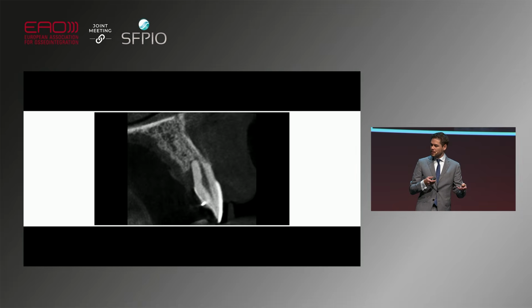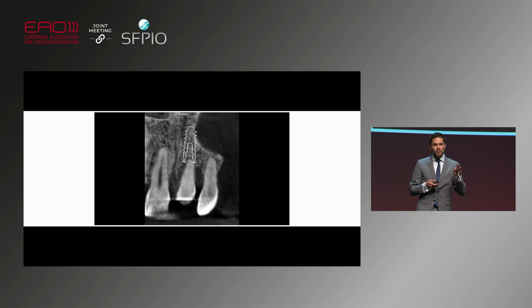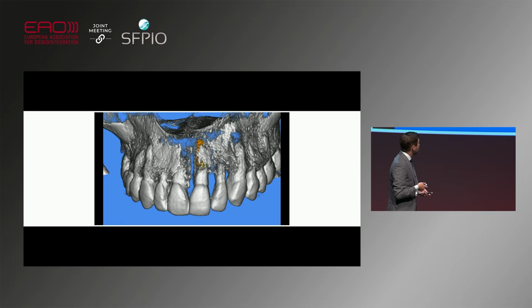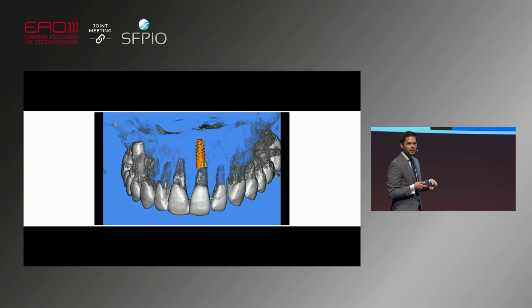But here, different case scenario, also a hopeless tooth. I can place the implant very comfortably. You see, I can anchor the implant. I will certainly have enough primary stability. I'll be able to put a provisional restoration. But if we take a minute and observe this, how far am I from the adjacent insertion, for example, of the central? Take a look here. When you see here, this is the shoulder of the implant. Take a look at the apex of the lateral. This implant is really, really high up. I don't want to do this.